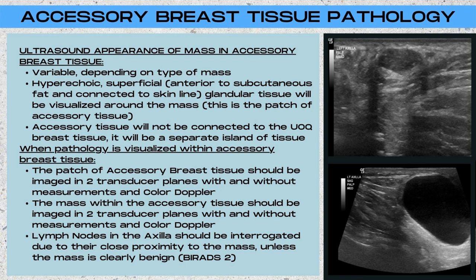It's going to be a separate island of tissue off by itself, located more superficially on the ultrasound image. When you visualize pathology within the accessory breast tissue, the patch of accessory breast tissue itself should be imaged in two transducer planes with and without measurements and with and without color Doppler, because it is an anomaly on the ultrasound. Any masses within that accessory breast tissue should also be imaged in two transducer planes with and without measurements and with and without color Doppler. Any mass found should be carefully characterized, and unless clearly benign — such as BI-RADS 2 — axillary lymph nodes should also be carefully interrogated due to their close proximity to the mass.